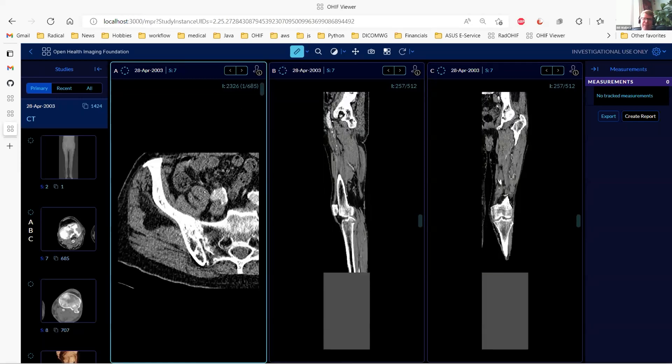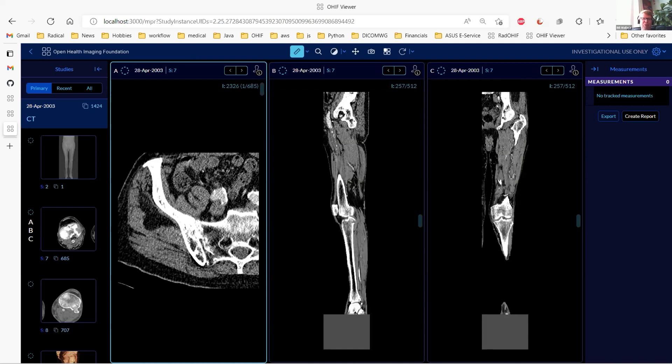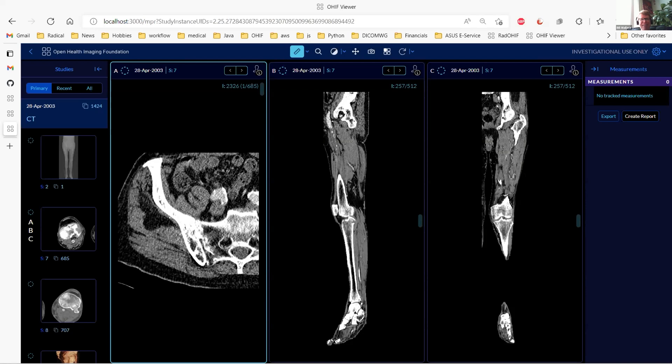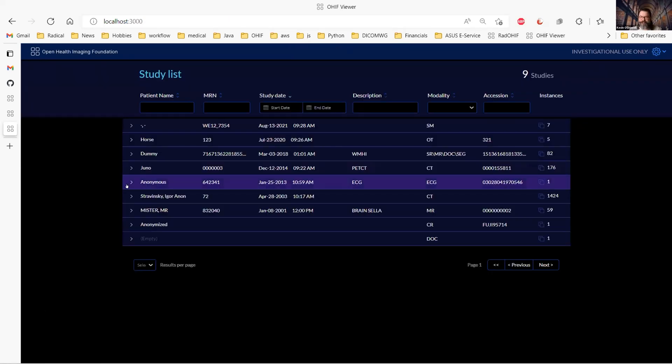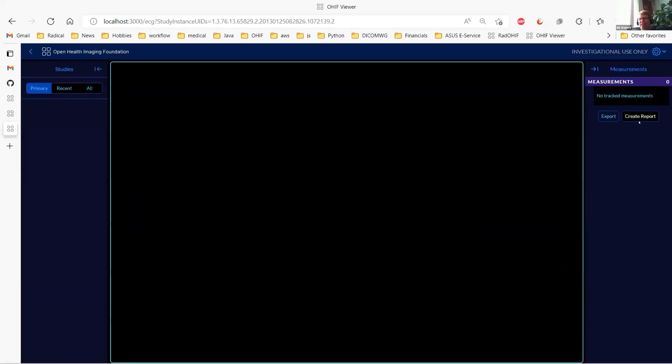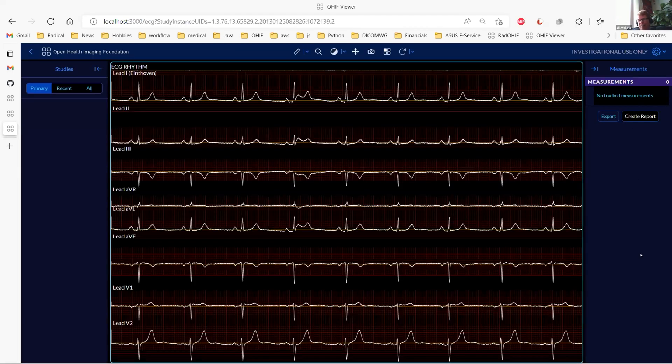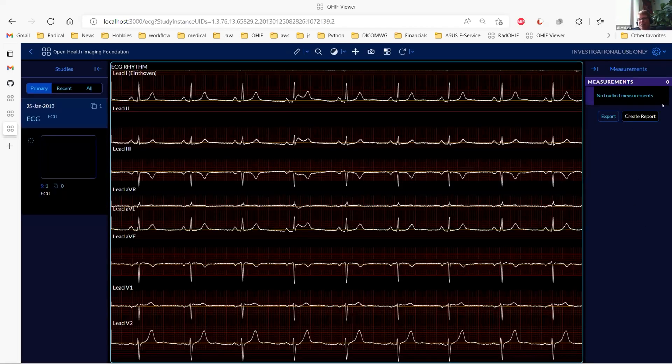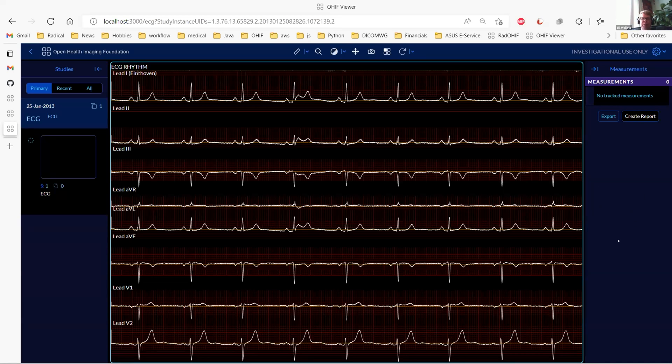Okay, so my structured report isn't working right now. That's what happens when you are working with bleeding edge software. But the idea is that one could add comments and things in here into the measurements.